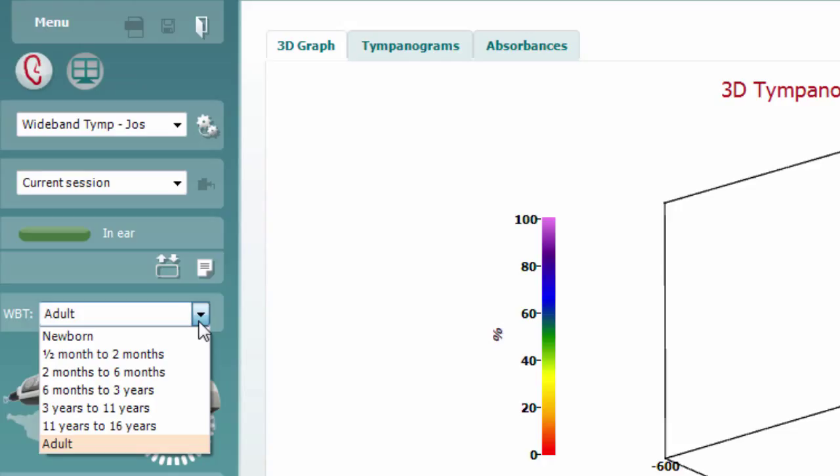If opening from AutoAccess or NOAH, the patient demographics will be correctly selected in the software automatically.